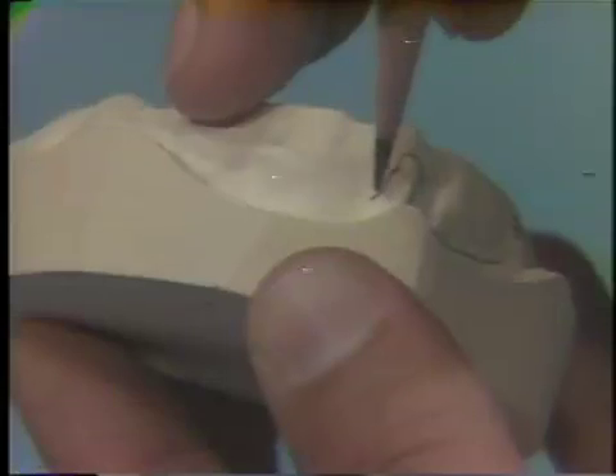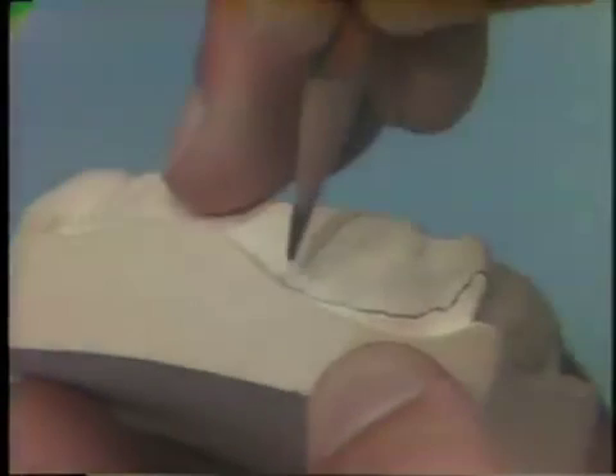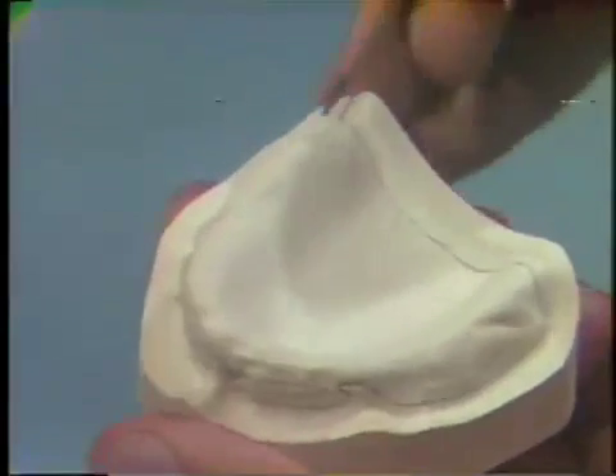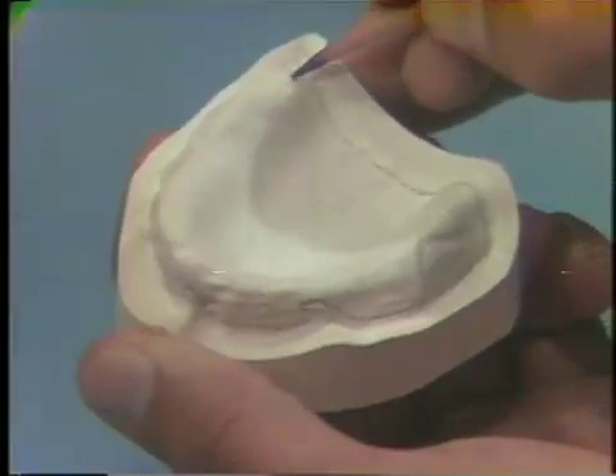Because this outline is arbitrary, you'll later need to try the impression tray in the patient's mouth and make some adjustments of the peripheries of the tray. Because you'll be adding wax relief on the diagnostic cast, you'll draw an outline for the relief two to three millimeters short of the denture base outline.